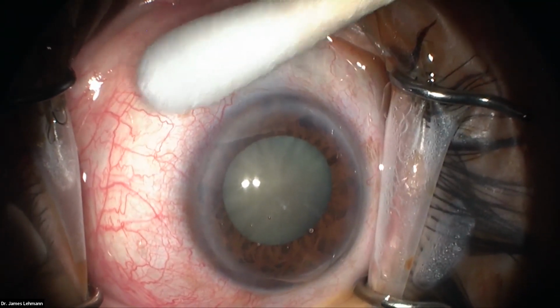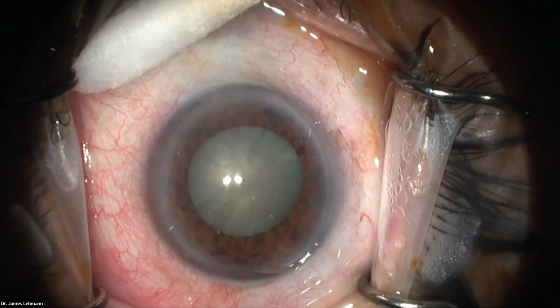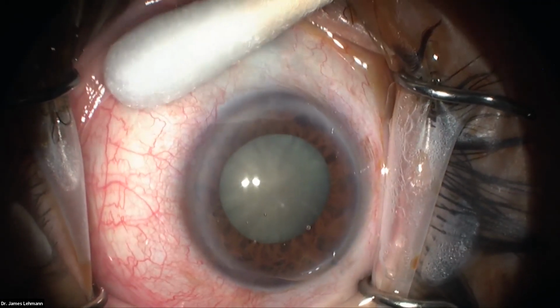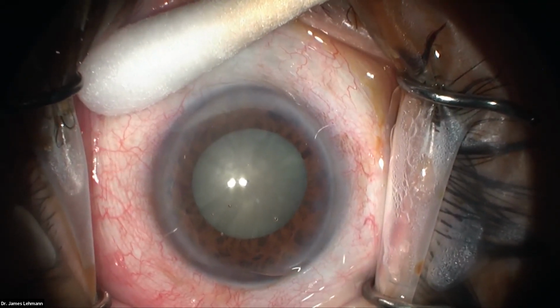So we saw his other eye in the presentation. It was a very dense cataract. This is the same, but there's always two kinds of dense cataracts. One is soft and one is hard. The other one was like a rock and very leathery. This one, it looks like to me that it's maybe one of those soft kind of mature cataracts, but I may be rethinking that in a few steps here.